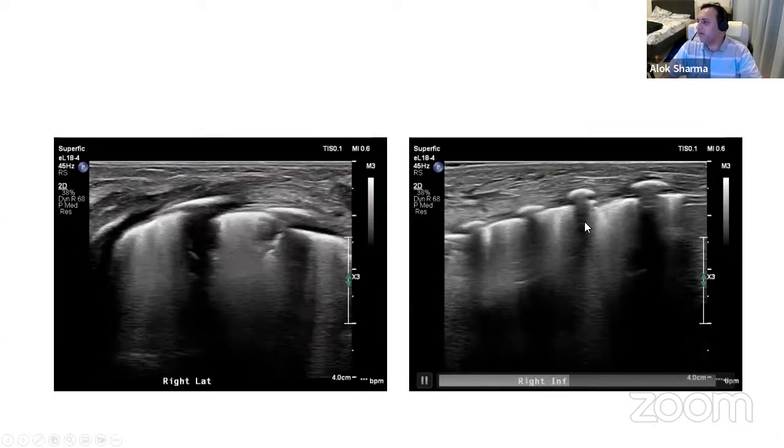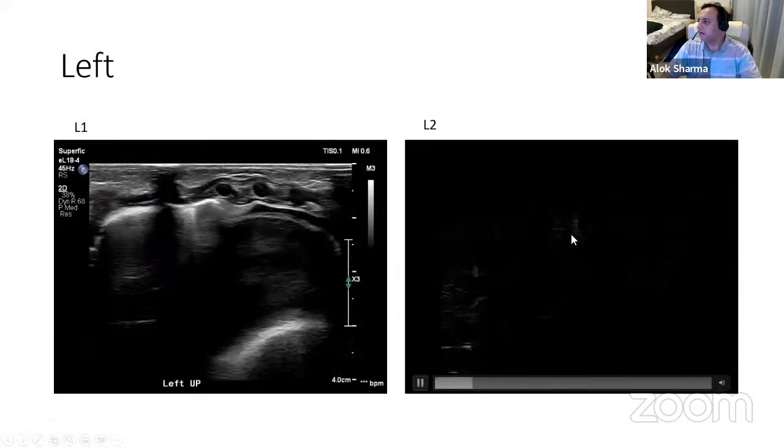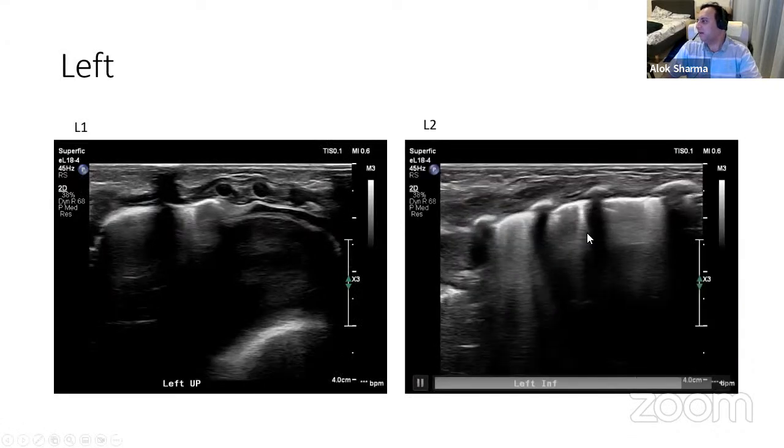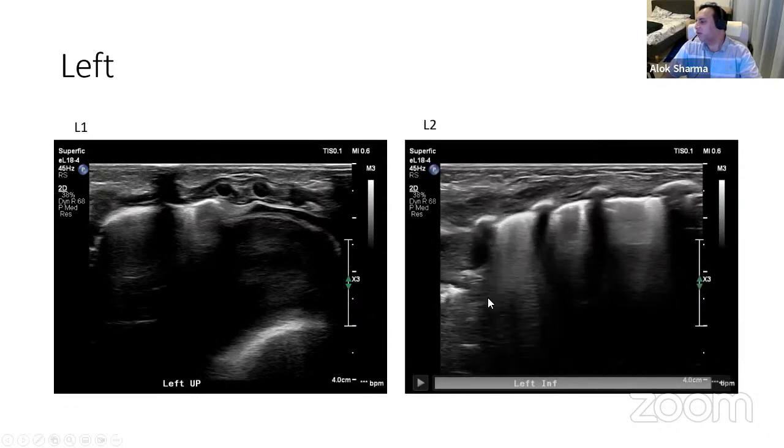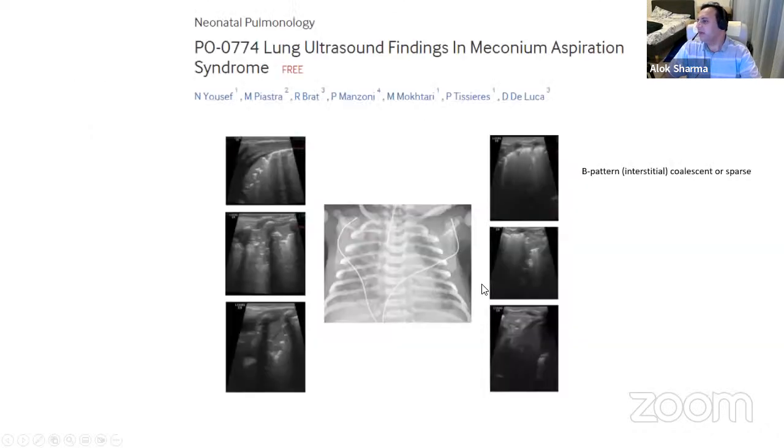But when I go to the next image, what I'm seeing at this particular point is really a deep consolidation with air bronchograms well within it, maybe a few A-lines at the bottom. So differential aeration, but what you get is a classical patchy appearance. And this is the classical X-ray appearance. You go to different regions, and that is basically atelectasis for you, a B profile. Again, this is atelectasis with some static air bronchograms because they're not moving. You can't even get a fractal sign.